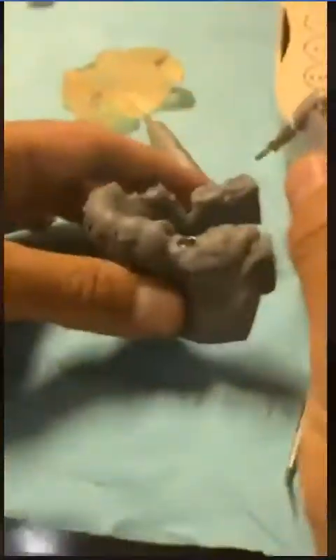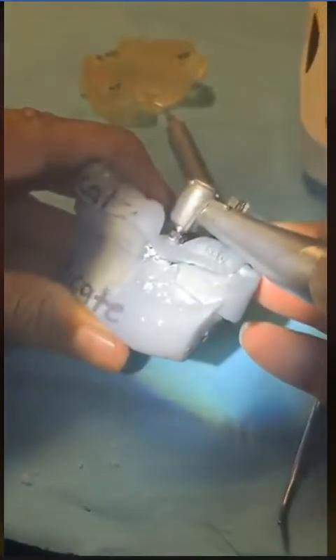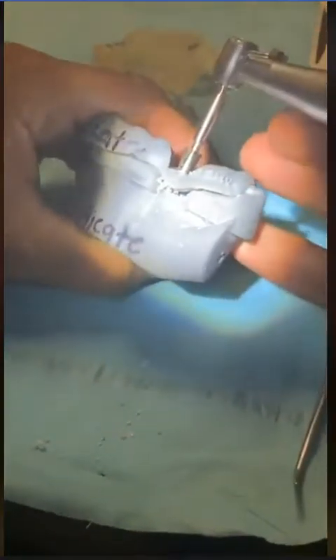So your first startup burr is going to be a 6 millimeter. So let's do this now with a 6 millimeter. I put it in. You saw that? Immediately goes in. Now take a look. I hit this. Now remember I told you I put an extension tube into my kit. It does not come with this kit. Why? Because the company does not believe that you will need an extension tube. But I believe you need an extension tube. So here is an extension tube. I put it back up.